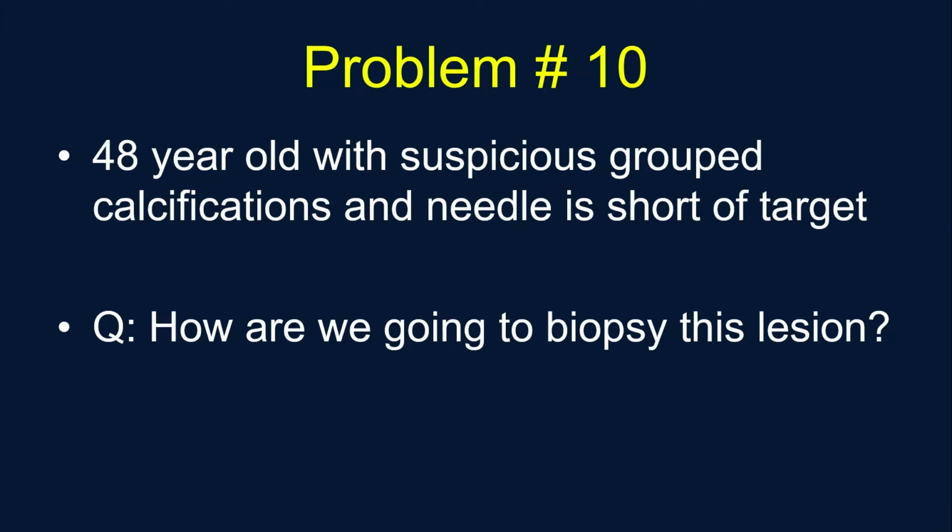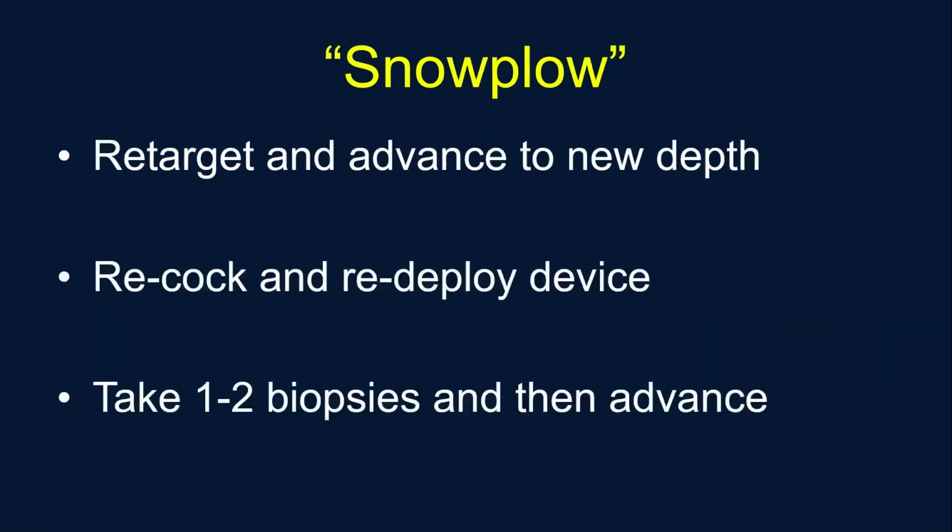So it happens sometimes that, surgeons will tell you that breast tissue is so variable in the OR. Some people have such dense tissue that the surgeon will tell you they go through 12 different scalpels just to cut out a piece of tissue. So some people's tissue is like a rock in there, and it just fights you every bit of the way. So you get what's called the snowplow effect, and you really have to be patient with this.